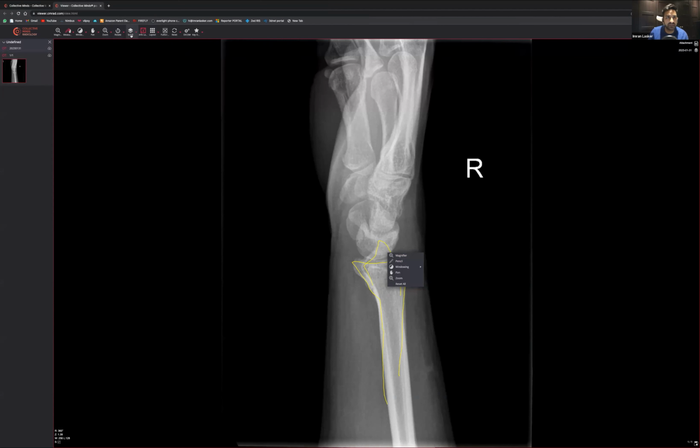Let's reset all. And you can see there is a fracture. I never heard that phrase before, I'm going to look that up. I've never described it that way, maybe it's a phrase I've never used before. But you can see there's a little discrepancy there. You can go along like so, and you can feel there's a discrepancy there as well. And then you go along like this.